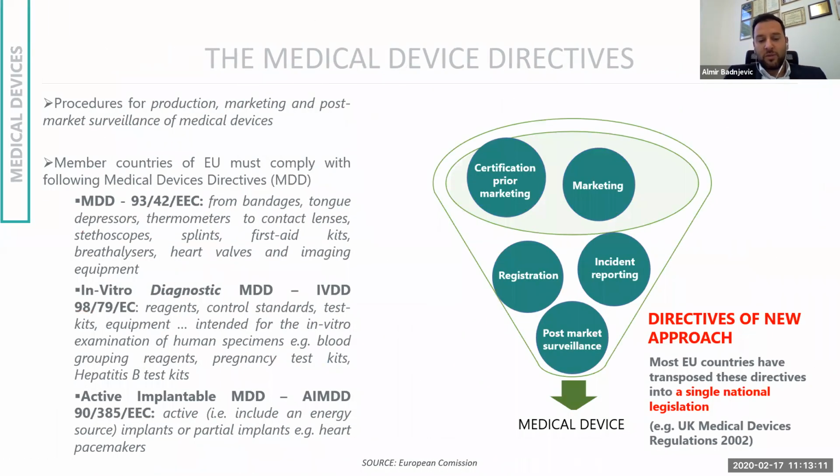When we are talking about the medical device directives, there are in fact three different directives, especially if we are talking about the European Union, but it is also on the international level. Those three directives are presented here in this presentation. And when we are doing anything regarding those directives, we have to have some kind of certification for our marketing. Then we have to do the marketing, registration, incident reporting, post-market surveillance. And those are all actions which are followed by each medical device. And it was in fact like that before.